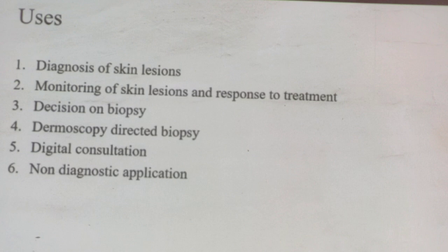Then dermoscopy directed biopsy. For example, if a lesion is larger, dermoscopy can give an idea about the area which is more representative of the pathology, from where we can take the biopsy. Then for digital consultation, dermoscopy helps. The image captured can be shared, which can be used for consultation or academic purposes, and hence it forms an integral part of telemedicine. Then other non-diagnostic applications include, it can help us in seeking the endpoint of many therapeutic procedures, or also after parasite extraction.